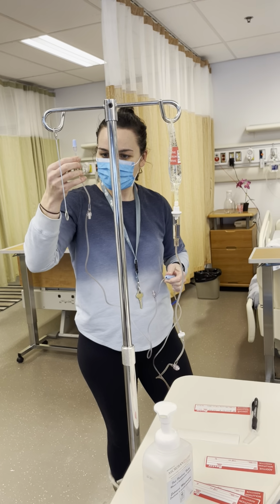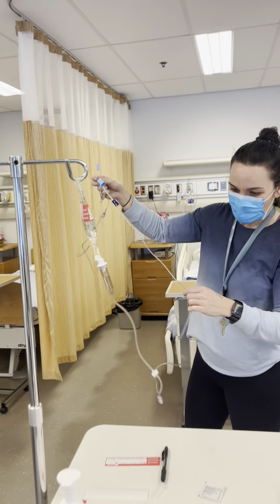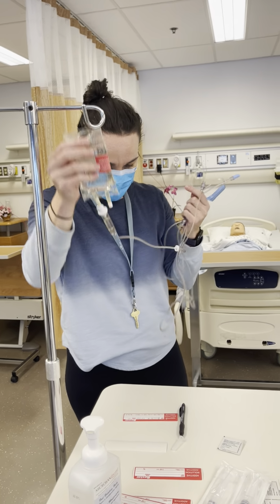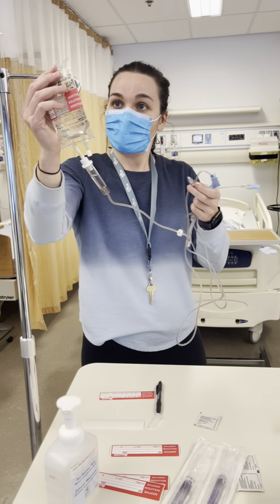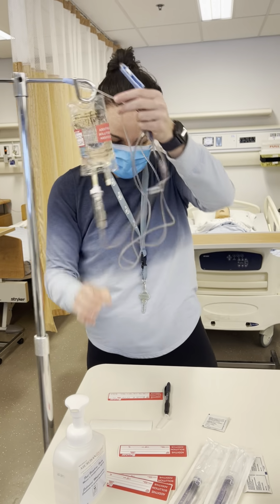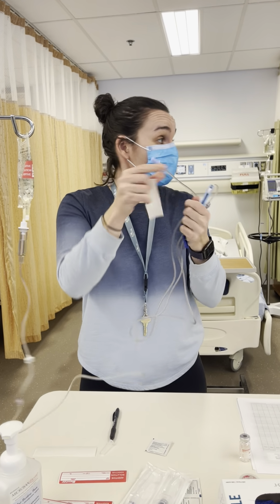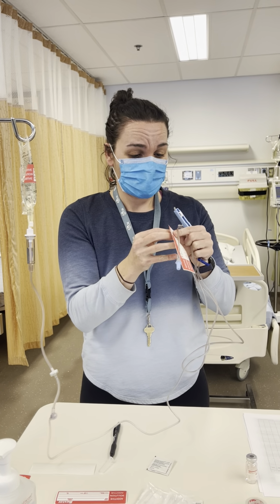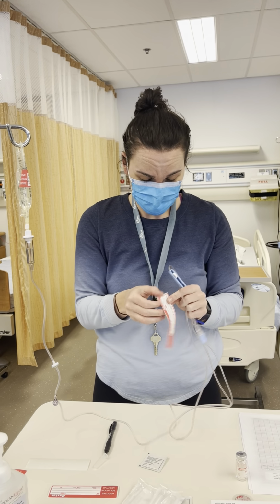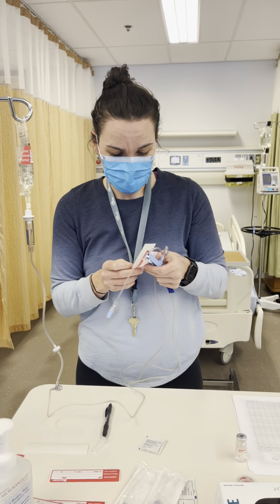There. Now we'll check for bubbles. That's pretty good. Okay, so that's good. So we can take this and put our label on our line too now, actually, since we're here. And then we're ready to go to bedside.